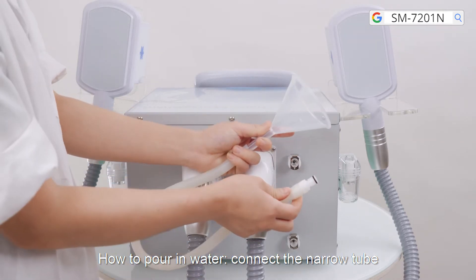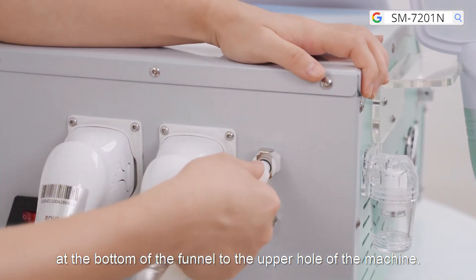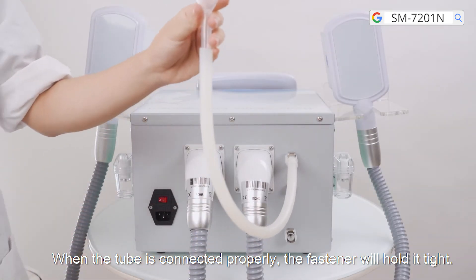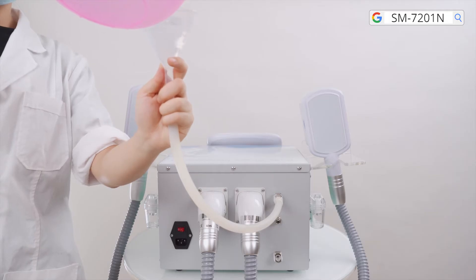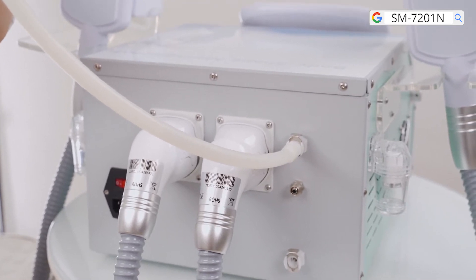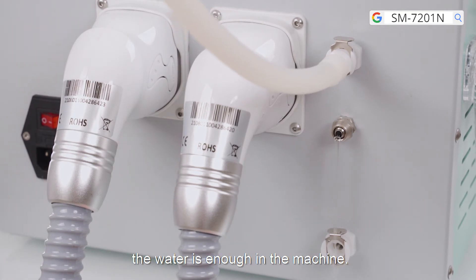How to pour in water: connect the narrow tube at the bottom of the funnel to the upper hole of the machine. When the tube is connected properly, the fastener will hold it tight. When there is water coming out from the hole in the middle, the water level is sufficient.